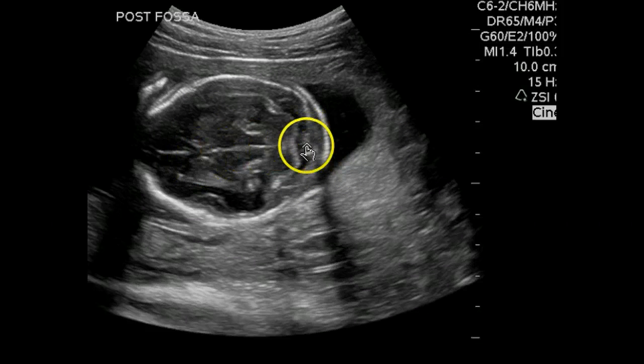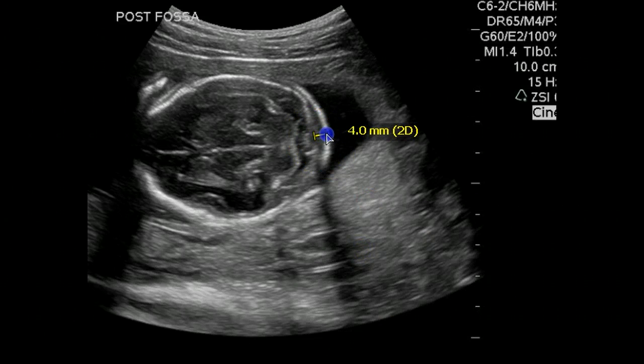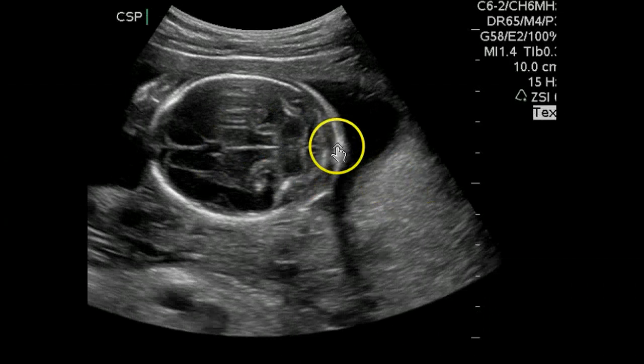You could actually be worried a little bit that the nuchal thickness is enlarged here. We can actually measure it. And even though it looks sort of big, it's still less than 5 millimeters. Here's a better measurement of it because we can actually see the posterior skull, so we actually know where to measure it. And this echogenic line is going to be the actual skin. You're going to volume average a little bit into other skin, so we're still less than 5 millimeters.